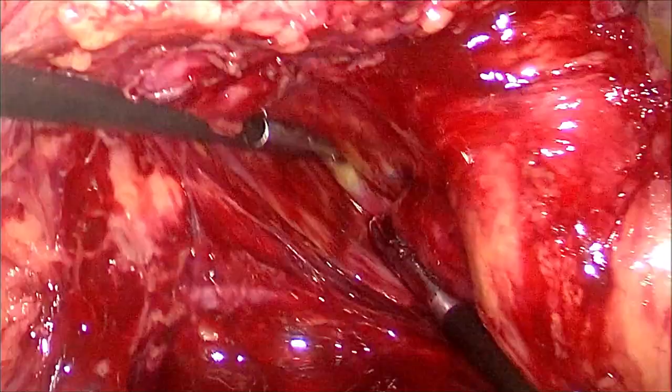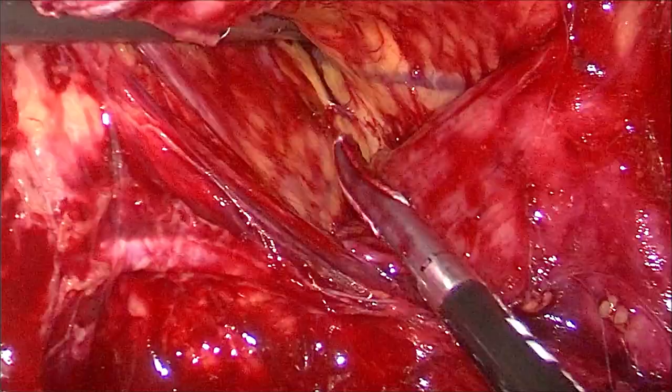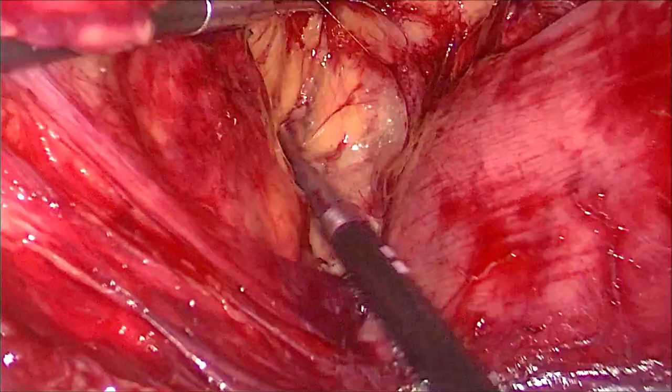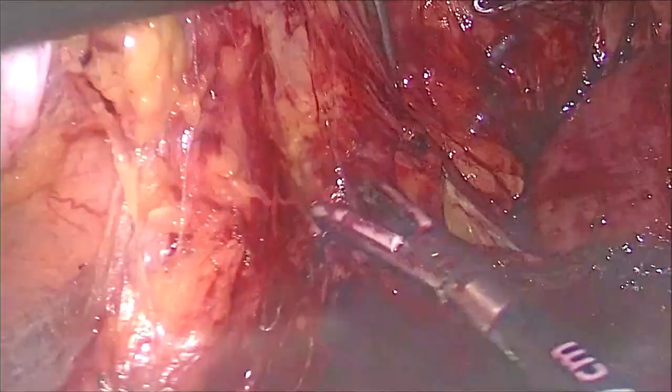A combination of sharp and blunt dissection is done. The duodenum is seen and brought down, and the complete C loop of duodenum is being dissected with a combination of blunt and sharp dissection. Dissection is carried as cranially as possible, up to the level of the liver.